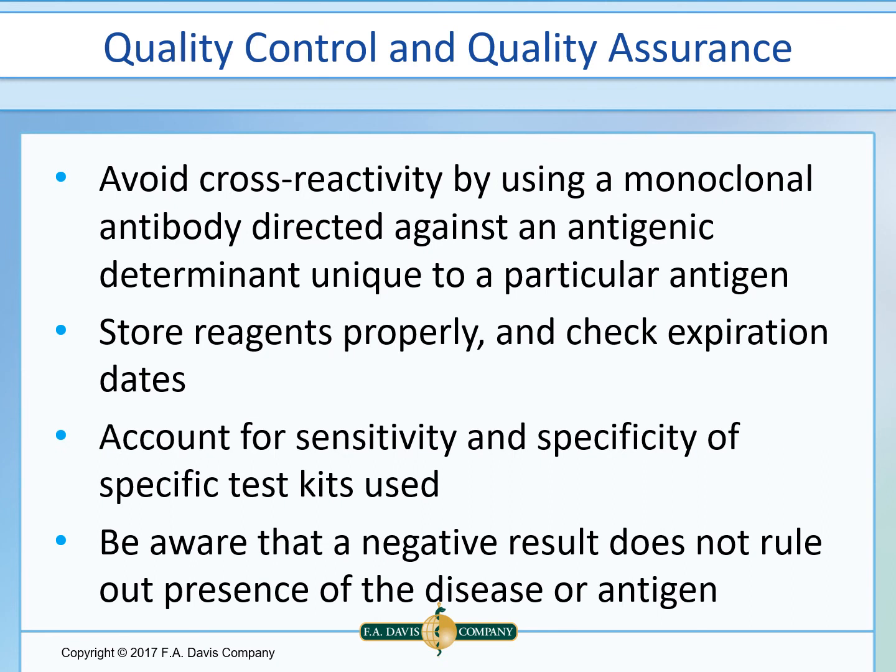The last topic discussed in this chapter involves quality control and assurance, particularly for these precipitation and agglutination reactions. Because even though these are fairly simple to perform, interpretation has to be done carefully. Techniques need to be standardized regarding the concentration of antigen, incubation time, temperature, diluent, and the method of reading, and taking note of possible cross-reactivity and interfering antibody.